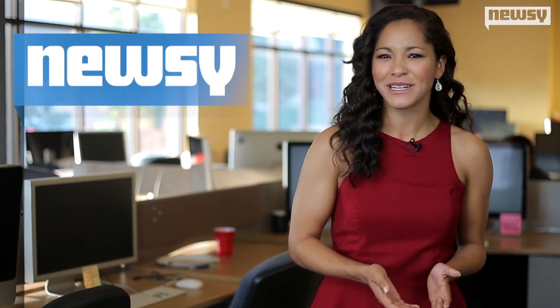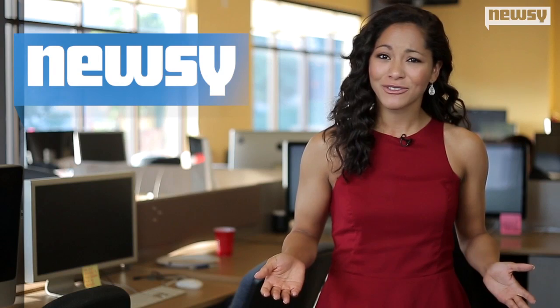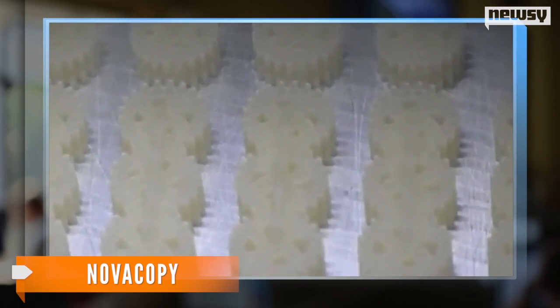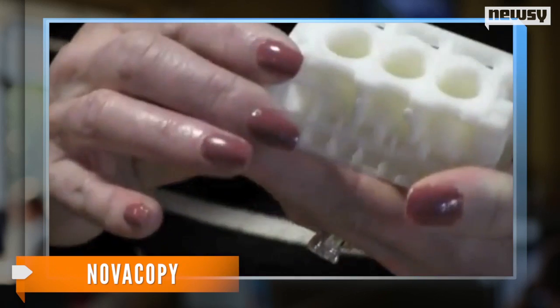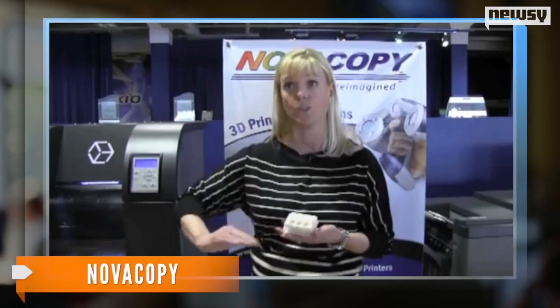So how does the 3-D printer that will help change Buttercup's life actually work? Well, sort of like a traditional one. It starts with a digital drawing, and it will print out a 3-D object from that digital file. The printer looks at the model, analyzes it, and determines how many layers of material it will take to actually print or lay.